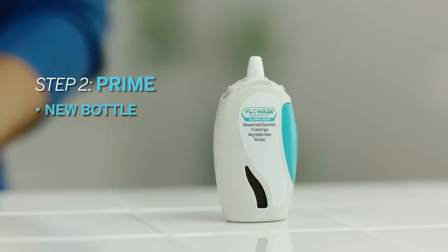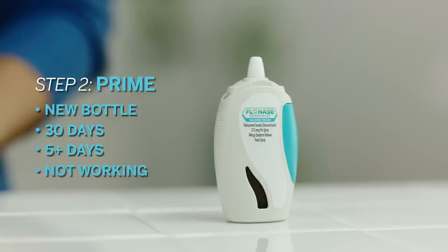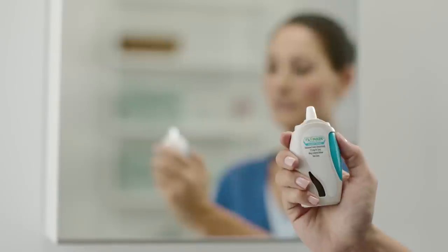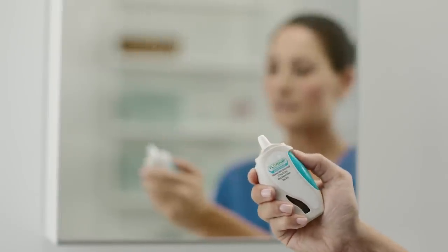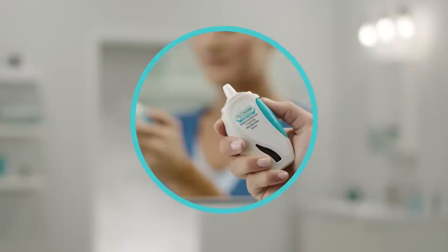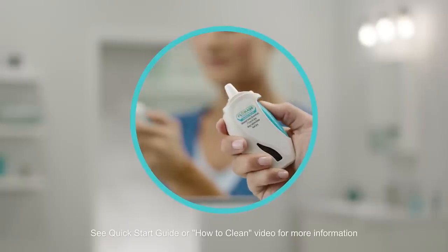When you're starting a new bottle, or if you haven't used the bottle in 30 days, if the cap has been left off for five or more days, or if the device doesn't seem to be working, your bottle needs to be primed. Pick up the bottle, aim away from your face, and pump until a fine mist appears. If you pump six times without seeing a mist, the spray nozzle may be clogged and may need to be cleaned.